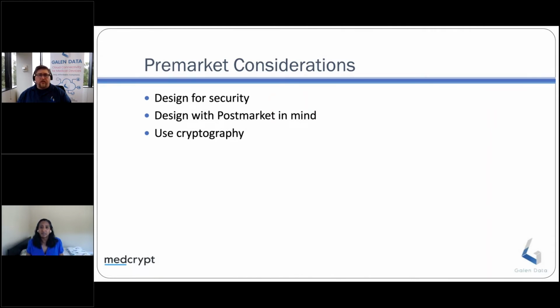Exactly. Having a 12-character long password in a healthcare setting like that, all that really does is get people setting 1, 2, 3, 4, 5, or something easy and quick to put in. So you might as well not have anything at all, or put it on the side.